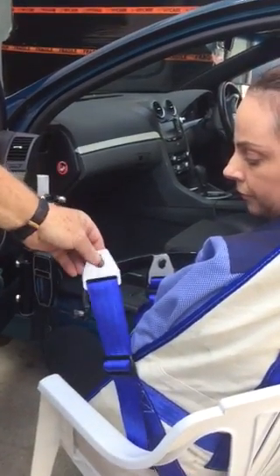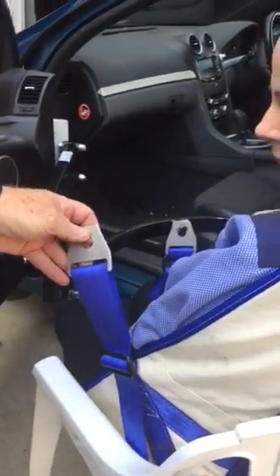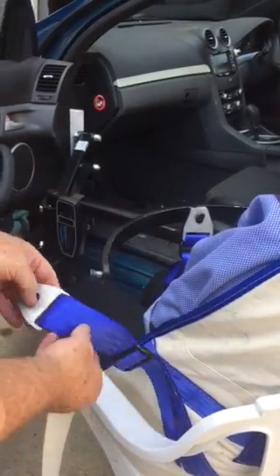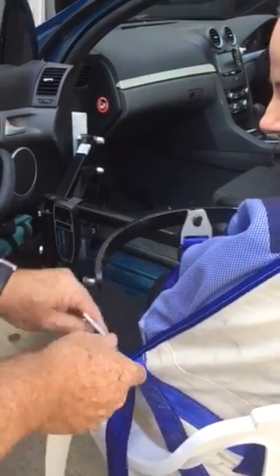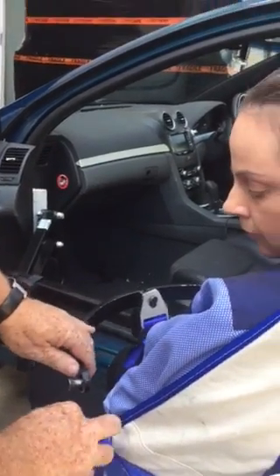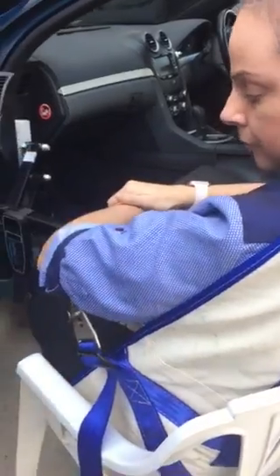First thing to do is to ascertain how long the strap needs to be. I can tell by the height of Tanya that this strap will need to be shortened. So I'm going to shorten that strap right up. It's important to make sure that we get the chest bar roughly in line with the person's chest. I can now hook that up and as you can see, that's quite short — that strap.